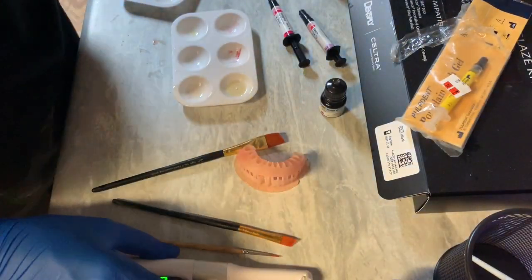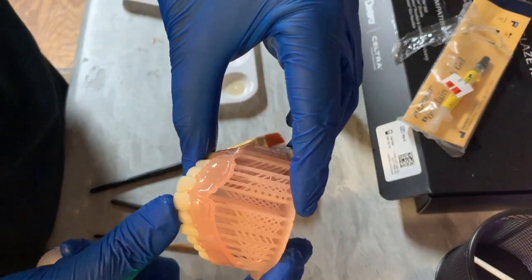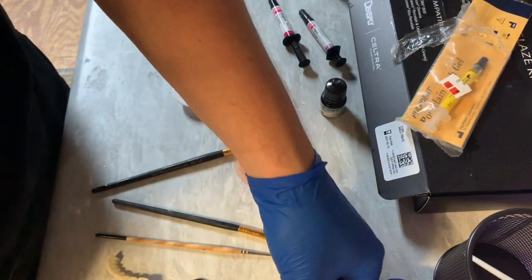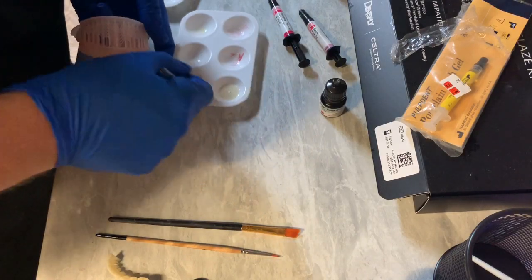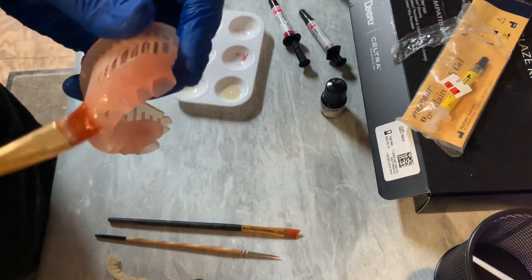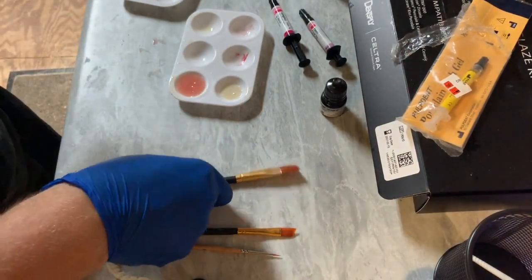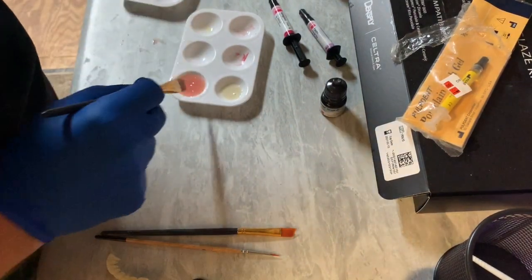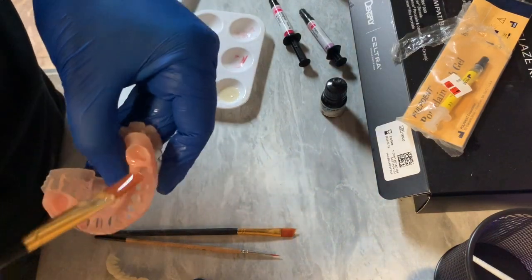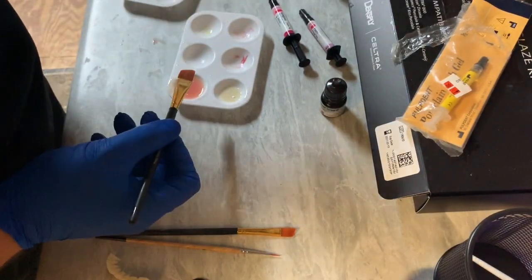We're back — got some more base resin here. And again, because I'm going to be bonding these teeth in, I'm going ahead and making this a little bit more liberal than I would otherwise.